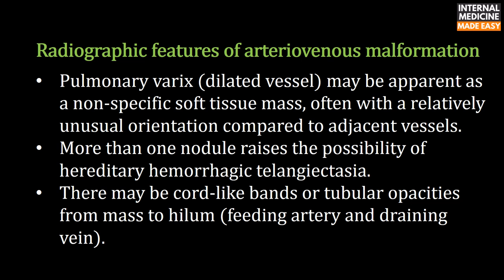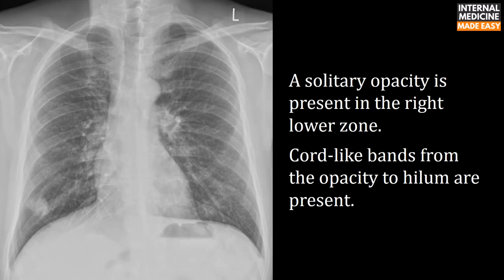Radiographic features of arteriovenous malformation: pulmonary varices or dilated vessels may appear as a non-specific soft tissue mass, often with a relatively unusual orientation compared to adjacent vessels. More than one nodule raises the possibility of hereditary hemorrhagic telangiectasia. There may be cord-like bands or tubular opacities from the mass to the hilum, representing the feeding artery and draining vein. In this X-ray, a solitary opacity in the right lower zone shows cord-like bands from the opacity to the hilum.